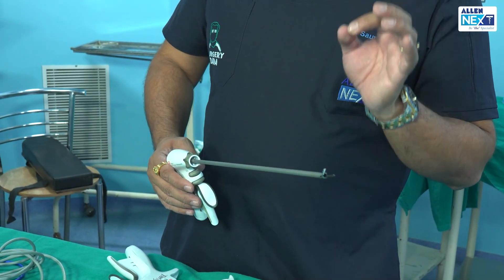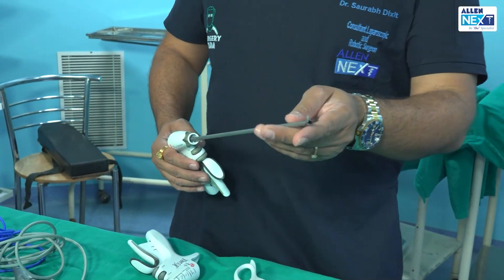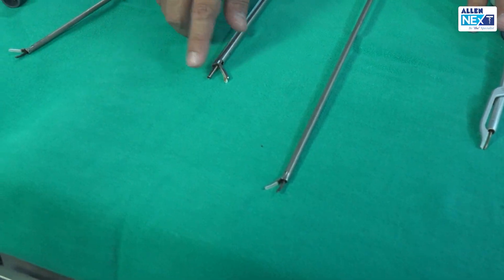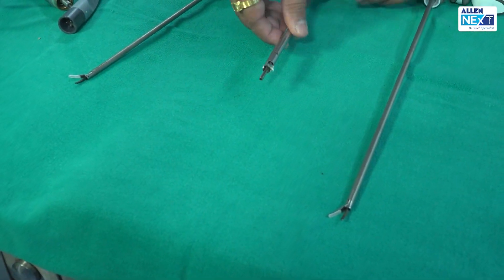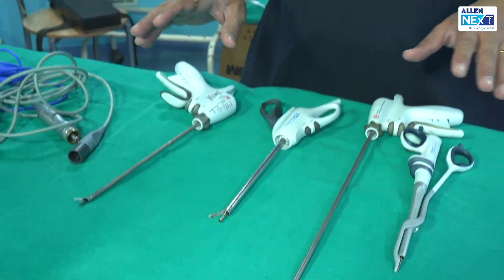It is not working on the principle of current — it works on the principle of ultrasonic energies. As you can see here, the lower jaw is metallic and the upper jaw is white-colored Teflon. So what are the various types of harmonics that we have?